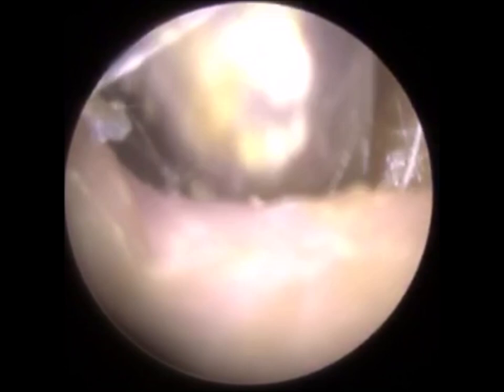It's difficult to see, but there's a trench there, and this plug of skin's right at the base, and I'm just trying to gently lift this using the suction probe. I'm really tugging at that. You can see how spongy and elastic this skin is. And with dead keratin, it tends to coil. You get ribbons of dead skin, and on occasions you will be able to visualize that as I'm removing the skin and lifting it away from the posterior canal wall.